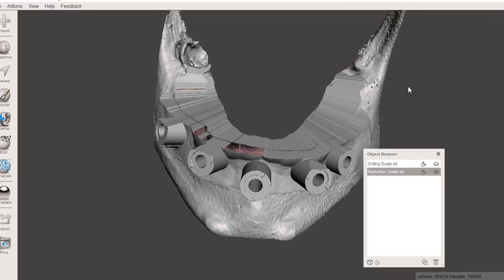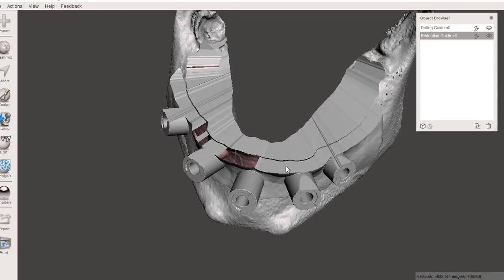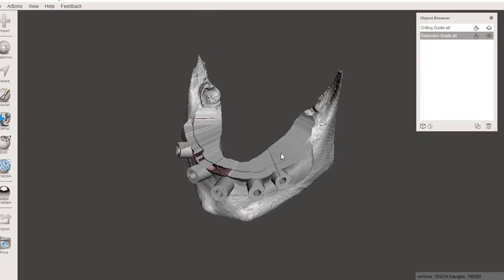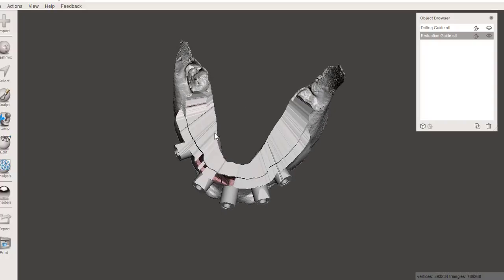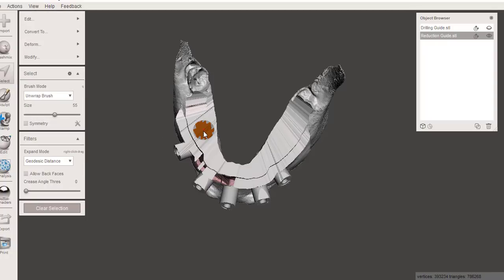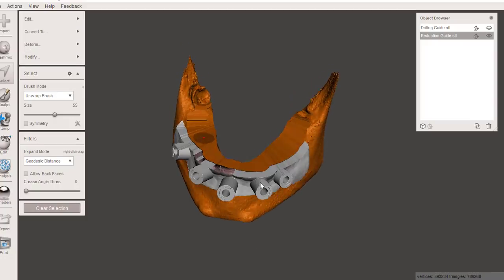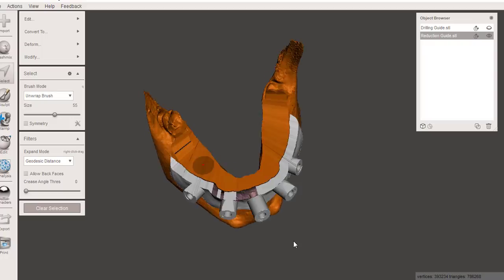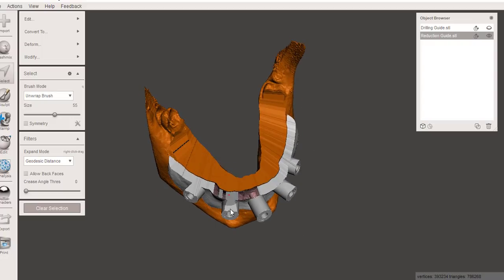Okay, so you can actually see here, I apparently forgot to uncheck the reduced jaw earlier when I exported this, but that's fine because we need to save this as a file too, and we also need to repair it. So since I've got this open, I'm going to come over here with my select tool, and I'm going to double click on this jaw. The jaw is going to be by itself what's known as a face group, meaning that even though these are saved as one STL, that is its own surface within the STL.